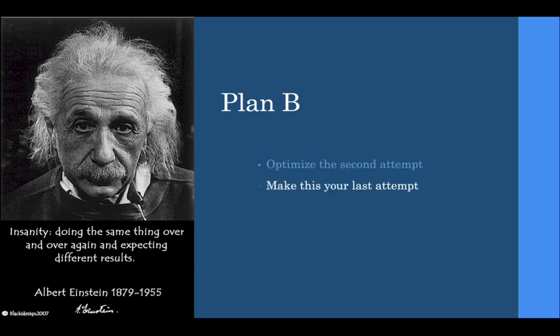Optimize the second attempt. Now I say make this your last attempt, but I don't say this in absolutes. We're going to talk about some complications here shortly with each attempt. So if I can't get an intubation on the second attempt, I better have a really good reason to risk a third attempt on a patient who a backup device could have worked on. So learn from your experience. With the person who tried the first time, be the person who tries the second time. So they're a veteran of that airway. Let them change their tactics and adapt. Caveat to this would be a really physiologic difficult airway and a new trainee, a new medic student. You don't want to put the patient in danger.